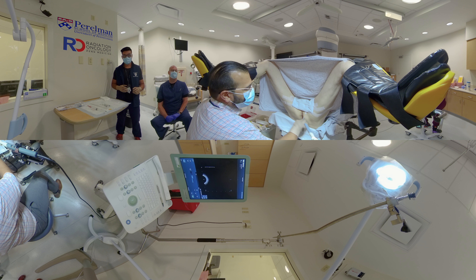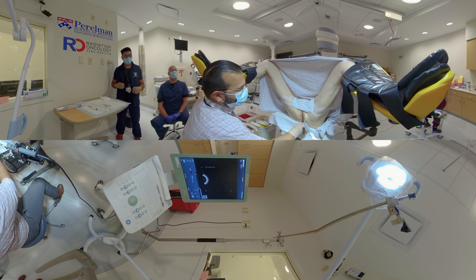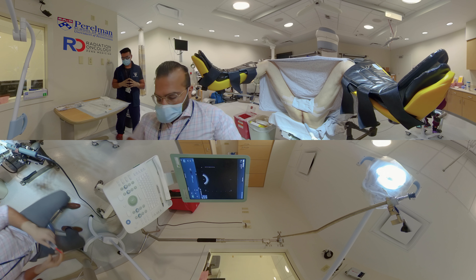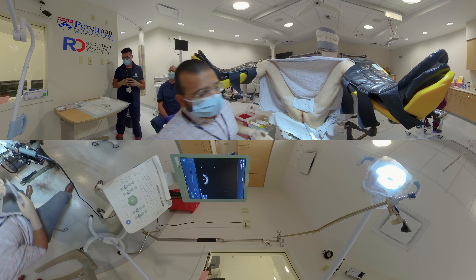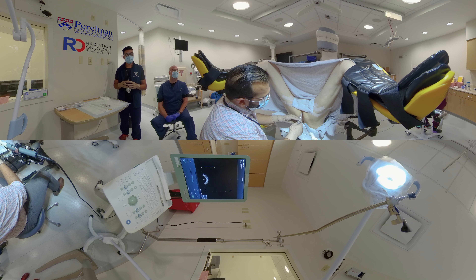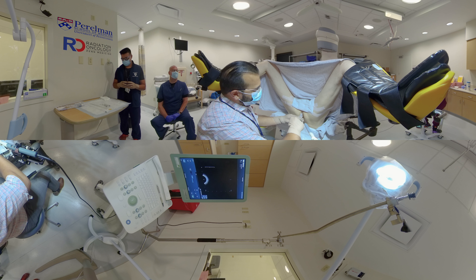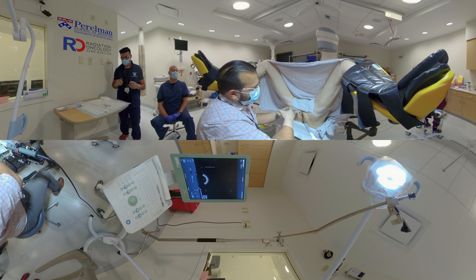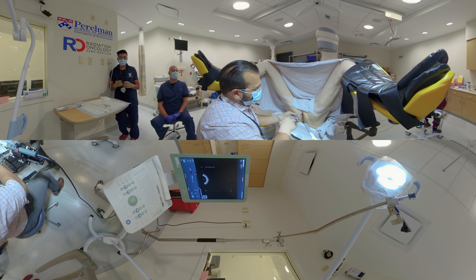First, we'll use the chlorhexidine swabs on the skin immediately anterior to the anus. The patient has already started pre-procedure antibiotics the day before, and he has completed a self-administered enema the morning of the procedure. I'll take the 23-gauge needle with the guard and attach that to the buffered lidocaine syringe. I'll create a skin wheal approximately 1.5 centimeters above the anus at the midline, then inject around this initial injection in a slight star-shaped pattern. Then, as I aspirate, I'll inject deeper up until the length of the needle into the perineum, using an estimated 6 to 8 cc. I prefer to do the skin wheal first so that the ultrasound probe is not the first thing that the patients feel.